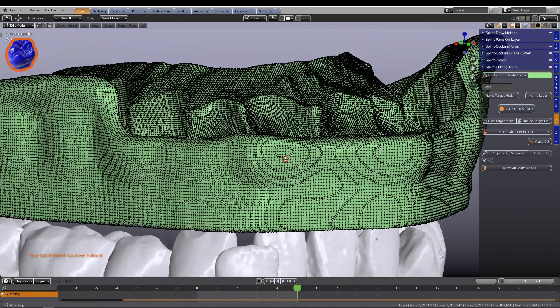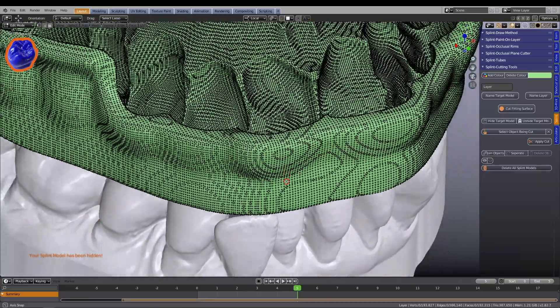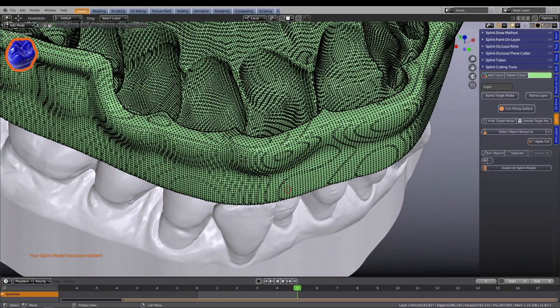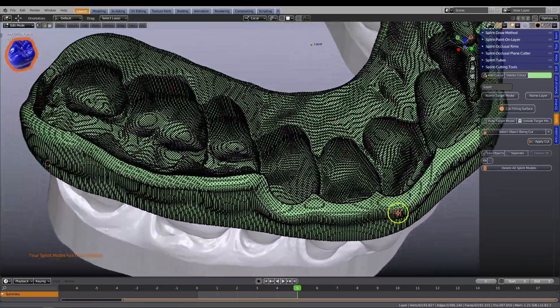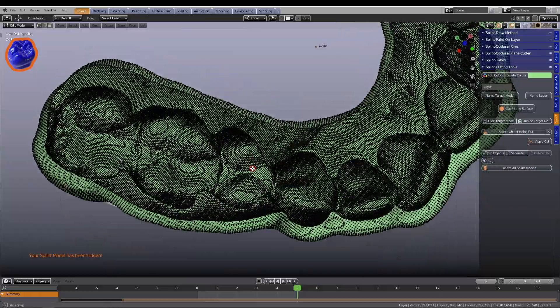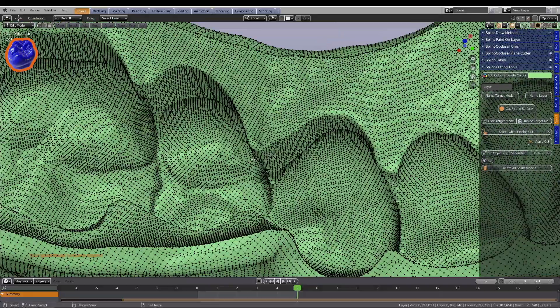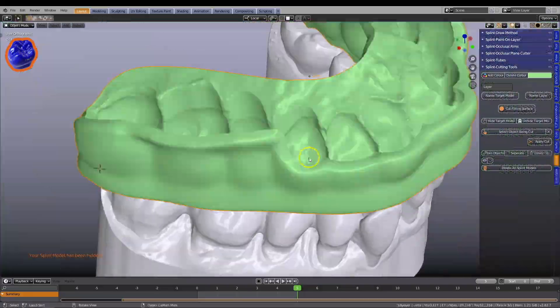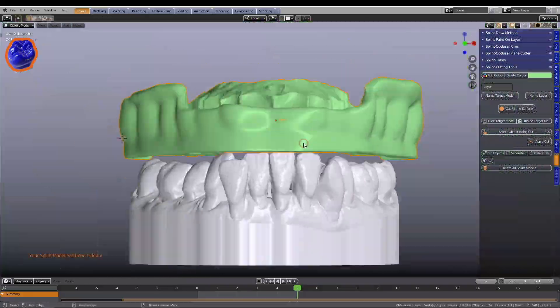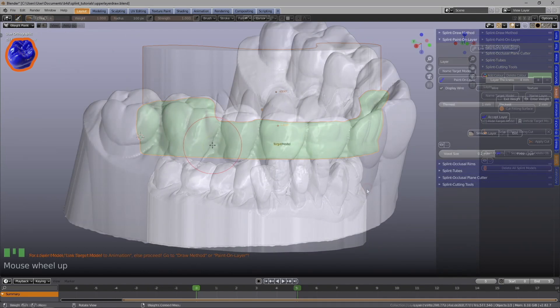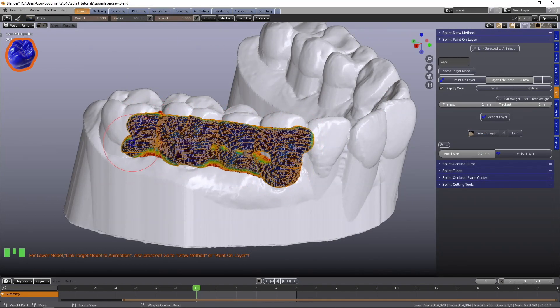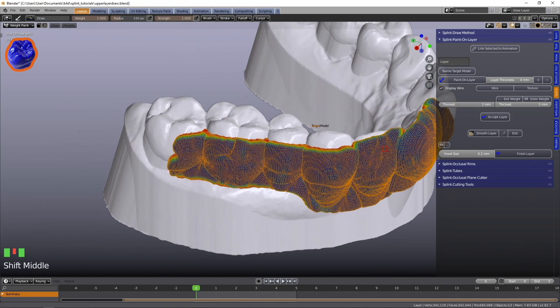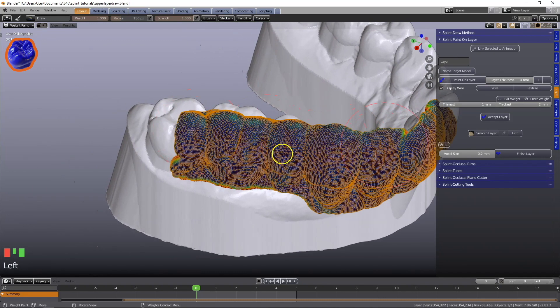To preserve the inner fitting surface, the design of the fitting surface is left to the very end. Here you can design your splint by simply painting the surface of the model.